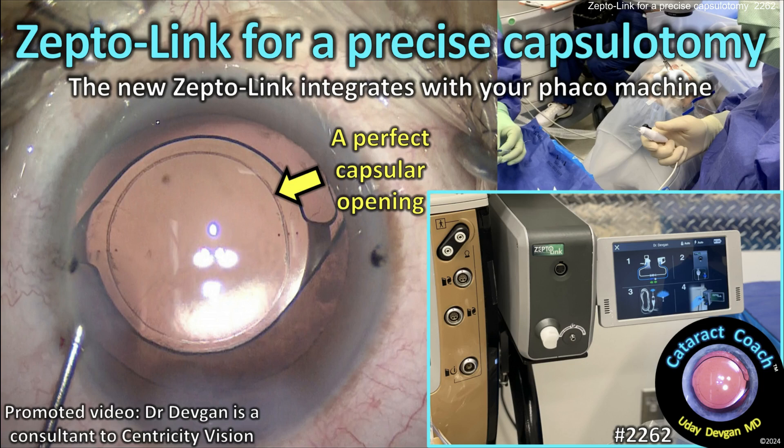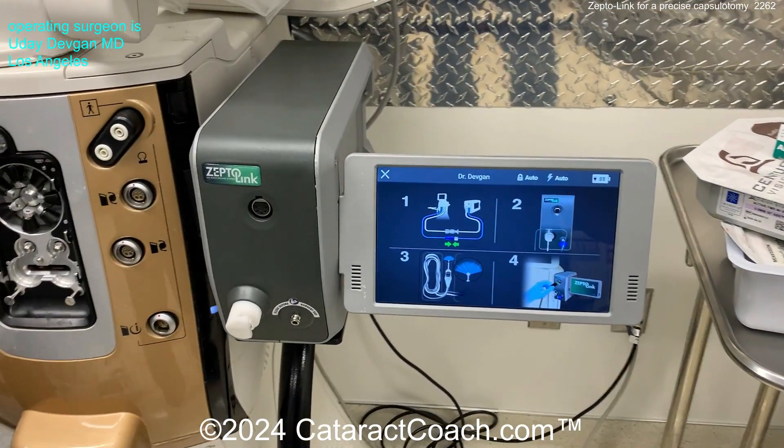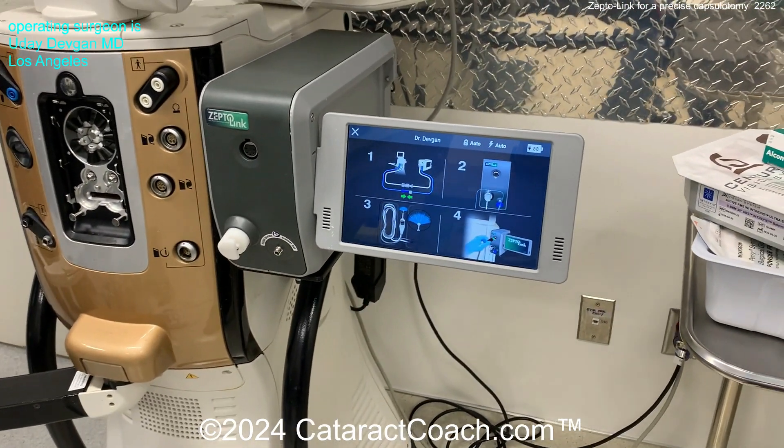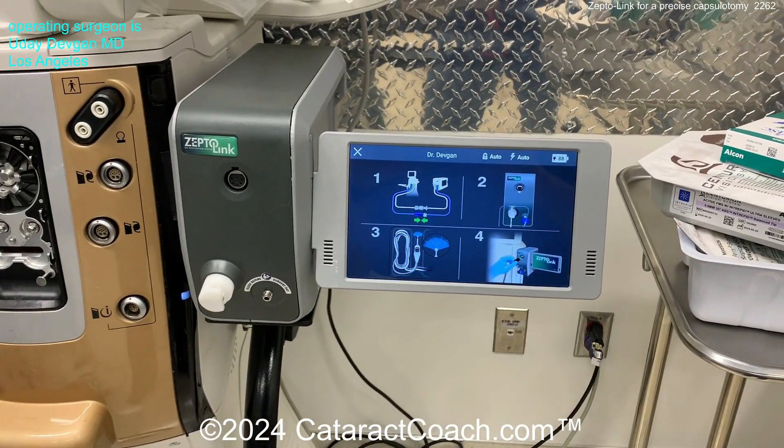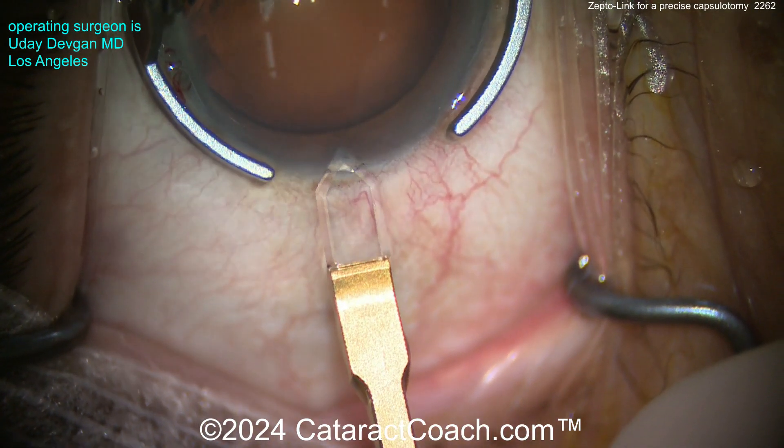Cataractcoach.com — ZeptoLink for precise capsulotomy. The new ZeptoLink device integrates with your phaco machine, making life really easy. Here's the device, mounted to your phaco machine. You control it using your normal phaco foot pedal — that's how it builds vacuum.